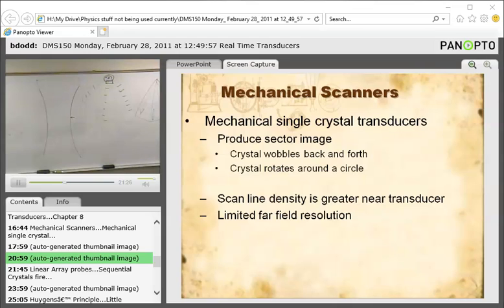All right. And again, the pattern that you're going to look at is from the transducer straight out and back. Okay. And that's not useful for a lot of things that we're going to be using transducers for today. We'll get into those. Okay. So there are some limitations.